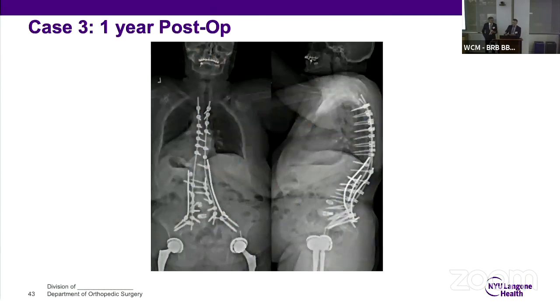So you expose the bottom, then you expose the top, and then you reposition a fiducial. At our place, we have both intraoperative 3D imaging options, as well as the preoperative CT, which we've done a lot of, marrying with intraoperative fluoro. And the robot also allows for 2-dimensional navigation, as if you're placing screws with Jamshidi needles, but you're just using the robot, and you're taking pure AP and lateral fluoro shots and then just navigating off the 2D, not taking a million fluoro shots to get your pedicle screw in. So there's lots of different options, but generally speaking, 2 acquisitions for a long construct like that.